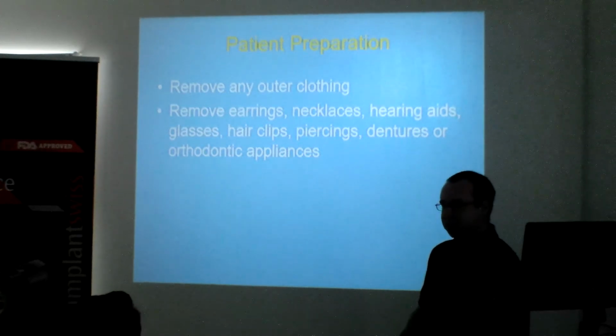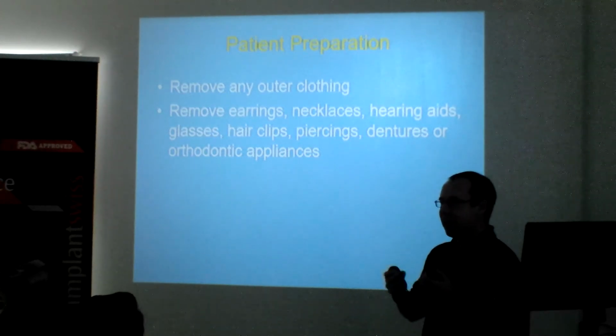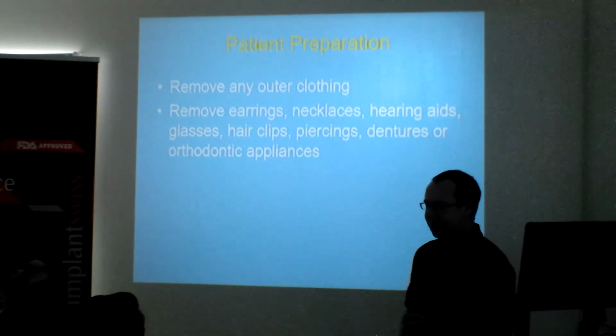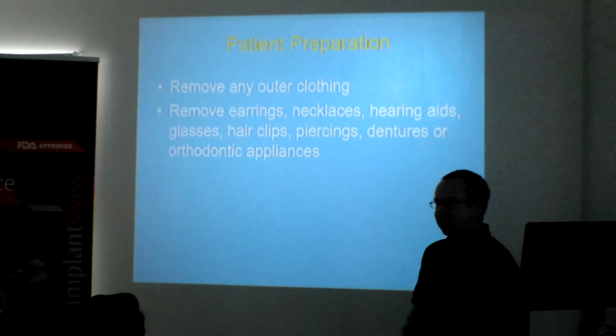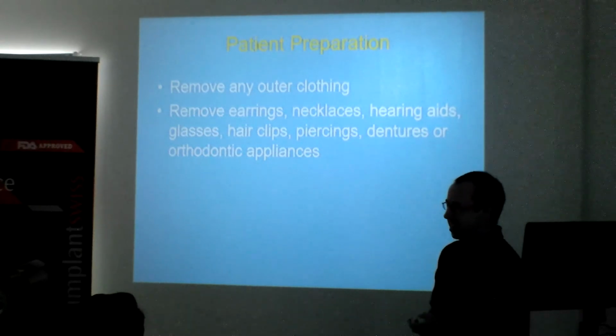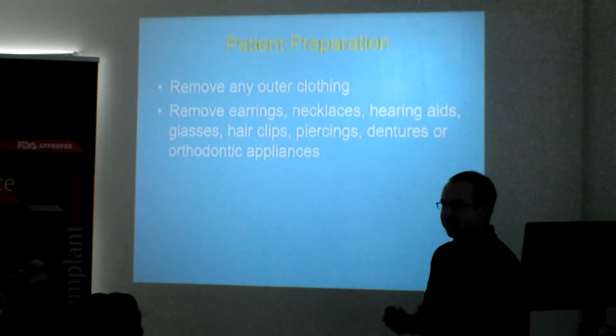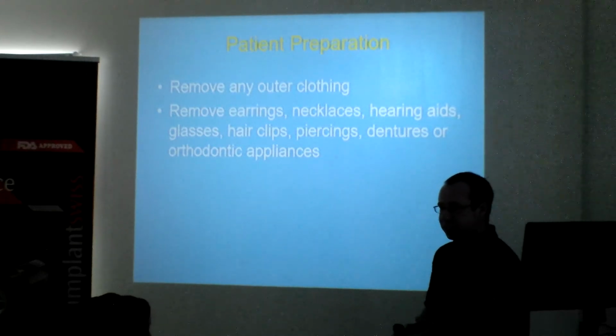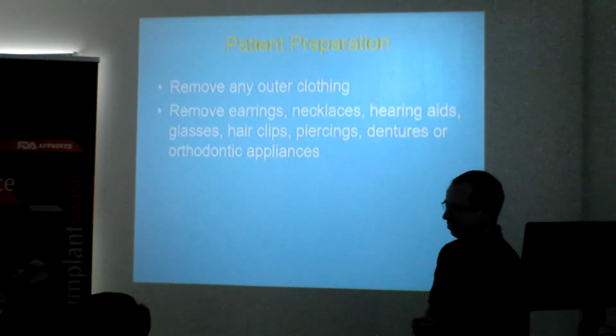We'll take a scan. We'll say to the patient behind, have you got anything in your mouth that you can take out? It's a very, very easy question to follow. You get the scan on the screen, they've got a denture in there. You say to them, are you sure there's nothing in your mouth you can take out? Oh, I have got a denture, but I haven't taken it out for a few years. So you start thinking to yourself, really?